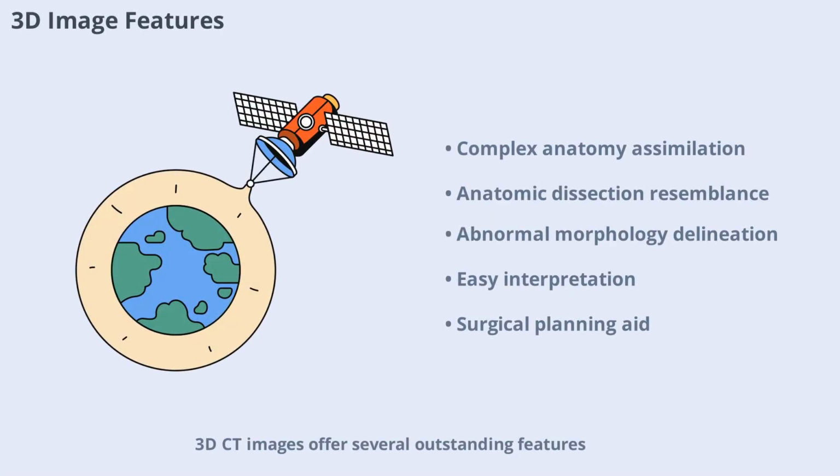3D CT images offer several outstanding features. Surgeons can easily assimilate complex anatomical relationships, as the images resemble anatomic dissections. The technique delineates abnormal bony morphology, provides easy interpretation, and facilitates efficient storage. Pre-selected views are automatically generated, simplifying the reconstruction process and aiding in surgical planning.